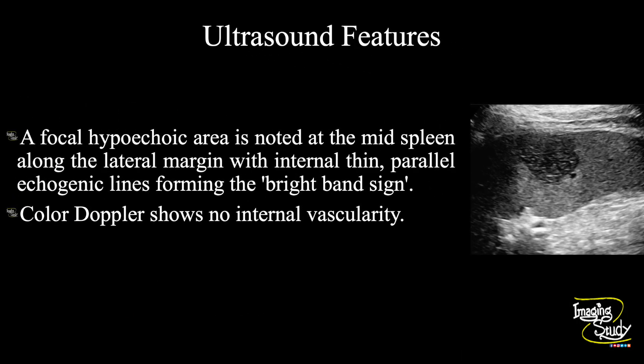In summary, a focal hypoechoic area is noted at the mid spleen along the lateral margin with internal thin parallel echogenic lines forming the bright band sign. Color Doppler shows no internal vascularity. These features are consistent with a case of splenic infarct — hopefully wedge-shaped.